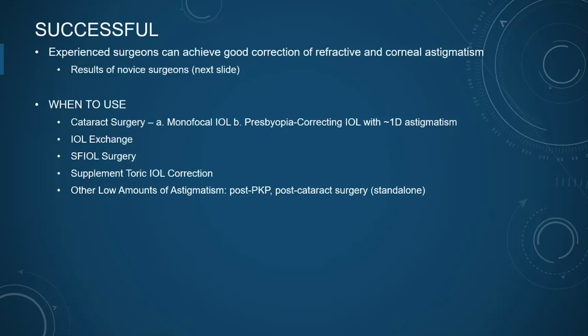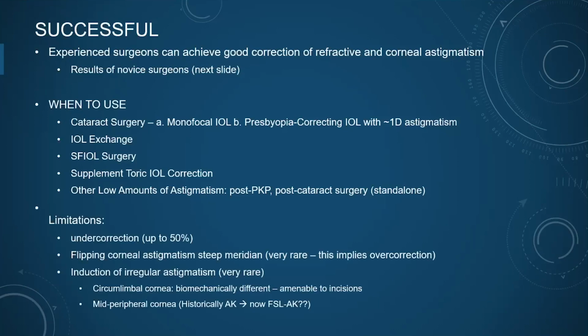Other cases of low amounts of astigmatism, such as post-penetrating keratoplasty, or let's say there's a patient who's post-cataract surgery. These can also be performed as a standalone procedure, even in the office or a minor procedure room, or if it really happened, you could go to the operating room for that.